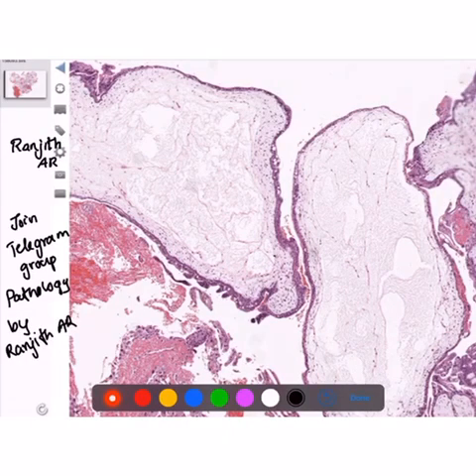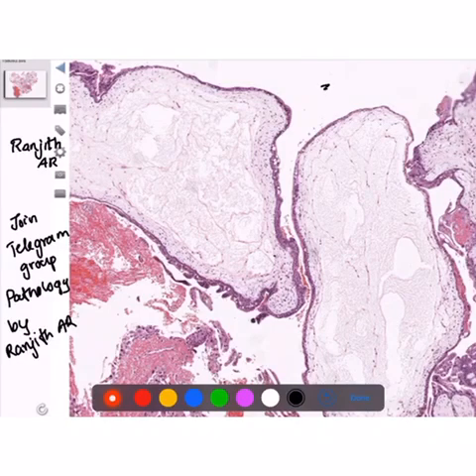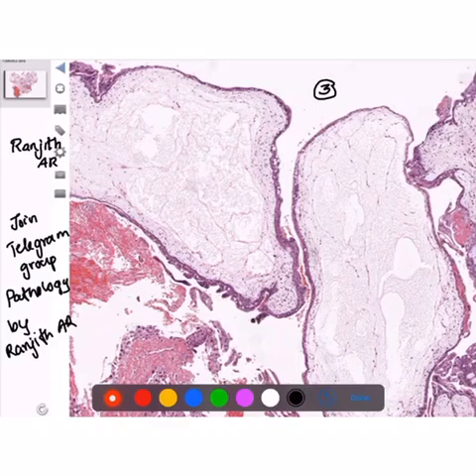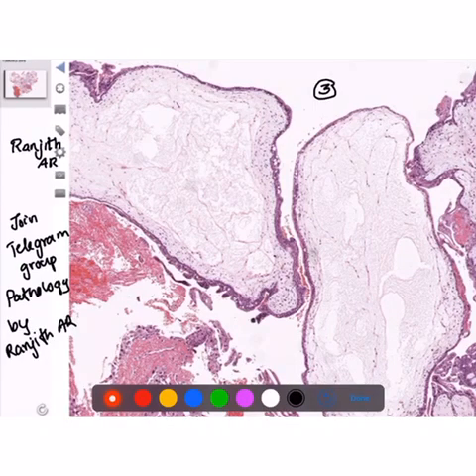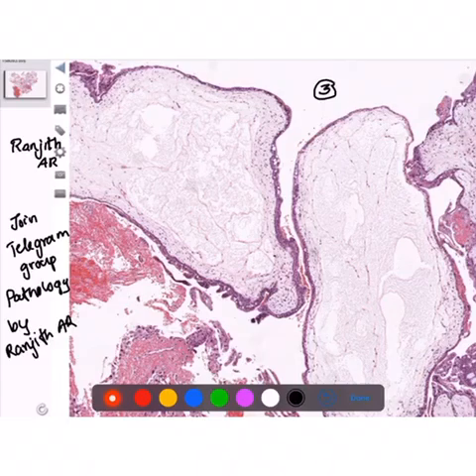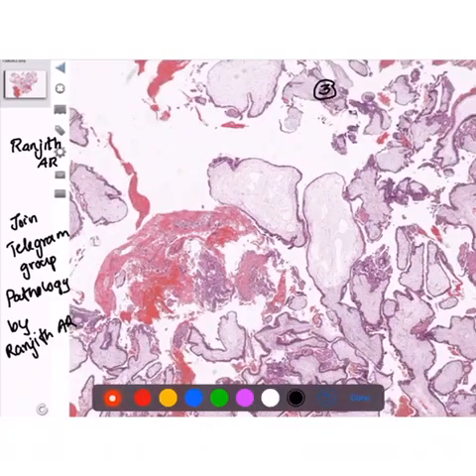So the microscopic features of hydatidiform mole — I'll name three things. One is multiple huge dilated villi. The second one is cistern formation, which is empty space in the center of the villi. Third one is a circumferential proliferation of both cytotrophoblast and syncytiotrophoblast.